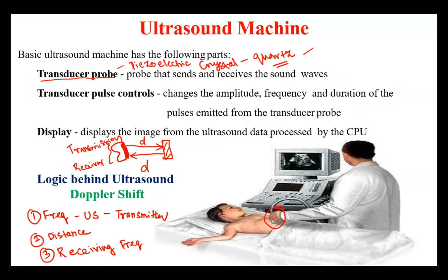And there is a logic behind ultrasound, a familiar concept called Doppler shift. So can anyone explain Doppler shift in 2 words? In the Anna University exam, if they ask you Doppler shift, the answer must have these 2 words for them to give you 2 marks, or else it's 0. So what are the 2 words? Doppler shift. Change in frequency, sir. Exactly. So change in frequency. Okay, so with Doppler shift there are a lot of numericals available.